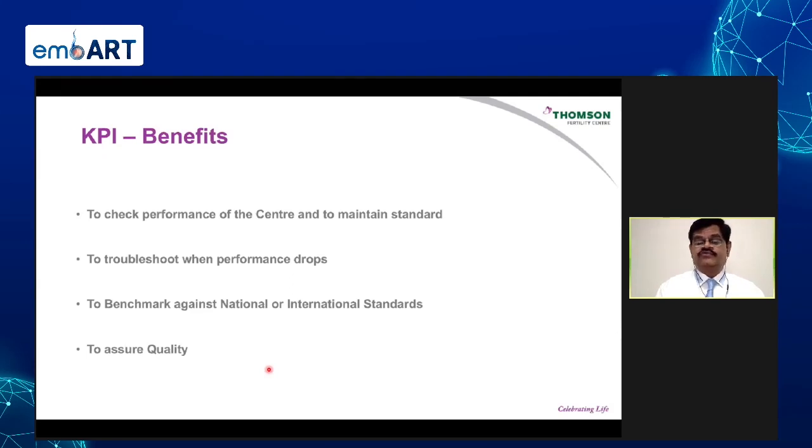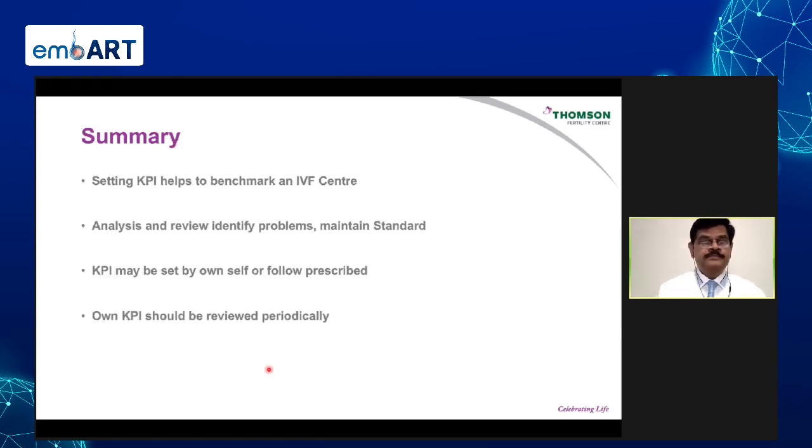Of course, you can check your performance and maintain the standard that is promised to our patients and clinicians, and also troubleshoot when your performance drops below a certain level. And this will help you also to benchmark against national or international standards to see how you fare with all other people, right? Of course, I don't need to say this, this assures quality. Okay. So to summarize, setting KPIs helps to benchmark an IVF center, and it is also easy to troubleshoot. You can actually identify problems so that you can maintain the standard of the center, right?